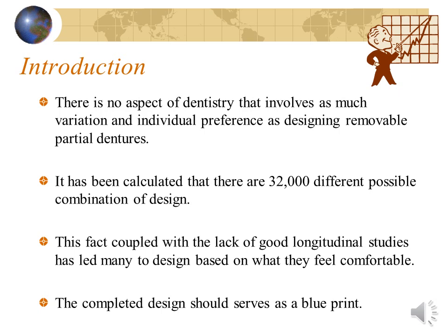It has been based more on what they feel comfortable. Designing the RPD framework should be done with great care, considering the biomechanical principles of RPD construction, and must be neatly drawn and positioned on the accurate diagnostic cast because the complete design will serve as a blueprint for the laboratory person responsible for RPD construction.